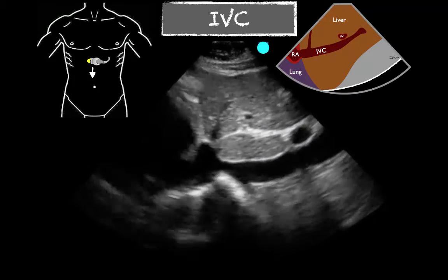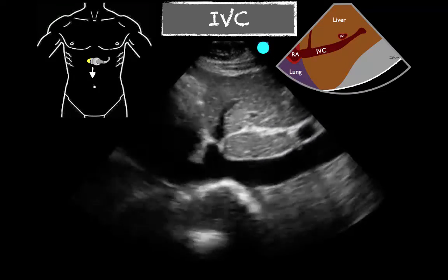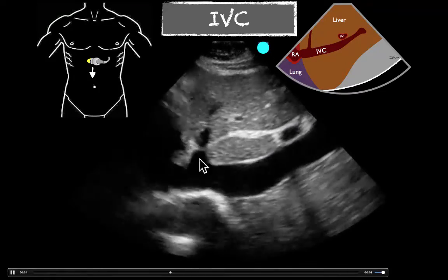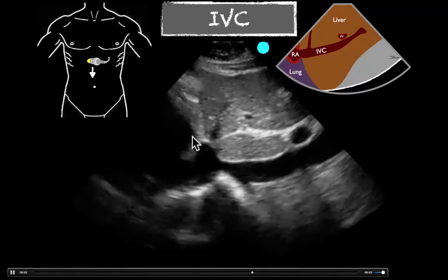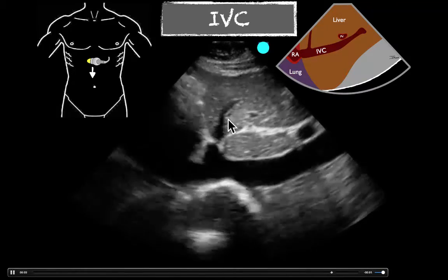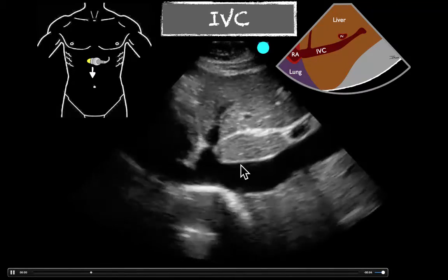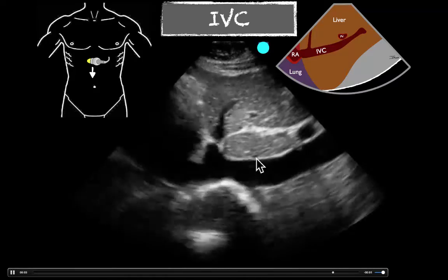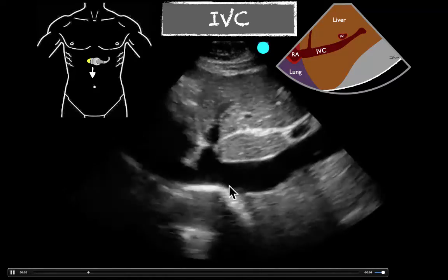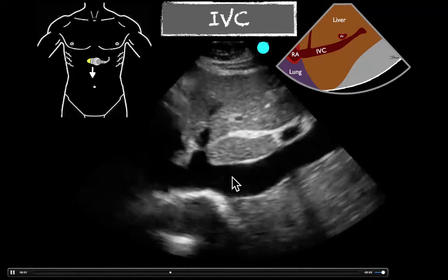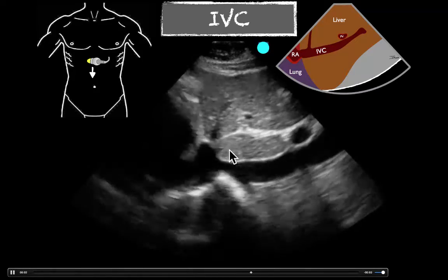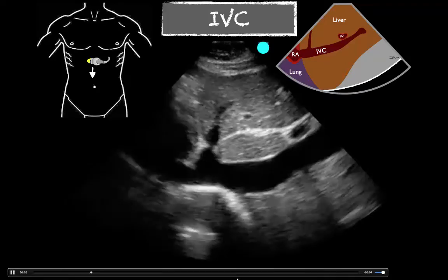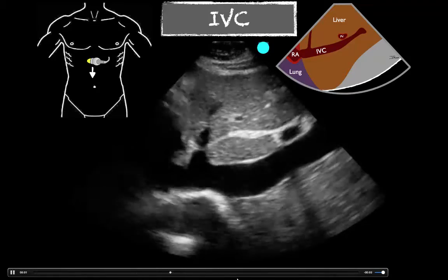When we look at the IVC here, here's another one. This one's not having to sniff as hard, but we see the diaphragm up here. Here's the hepatic vein. We're going to watch right here. The diaphragm kind of comes down right there, so it makes it a little less likely. I like to look right here if you can. We've got about 50% collapse.